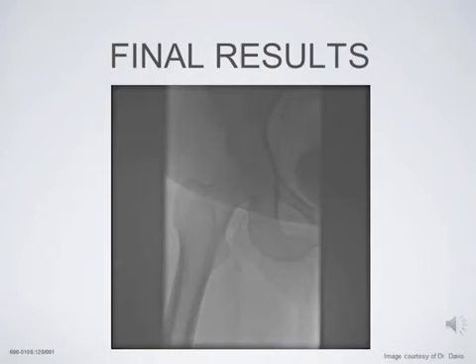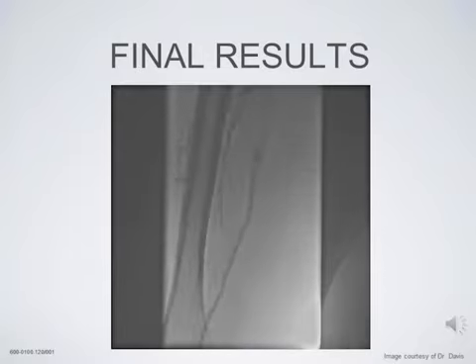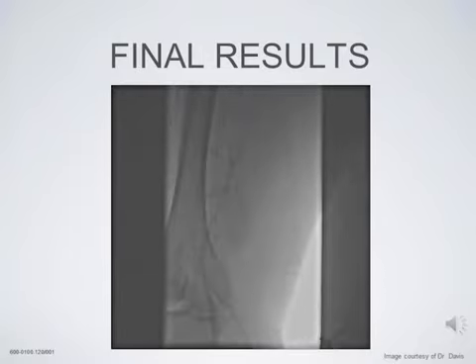As you can see after this, we've had a channel that goes through the vessel. And then post-balloon angioplasty. And the final results show very good patent lumen, good size, minimal dissections without any flow limitation, and certainly excellent flow down below the knee.